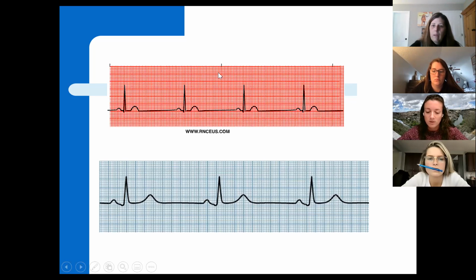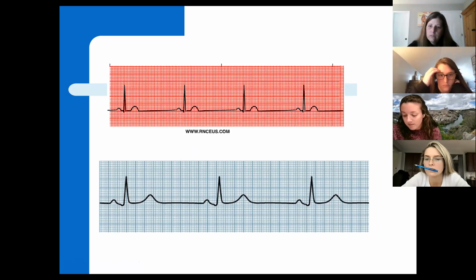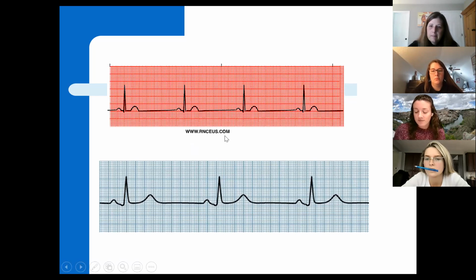I just have a question, like for testing purposes. When we first counted it one way, it was 37.5, and then counted it a different way, and it was 40. Are we going to have to answer open-ended, or is it just going to be kind of obvious what you need to do? It's not going to be, we don't have any gotcha kind of trick questions. It's going to be obvious. It might tell you what method to use to calculate it, though.